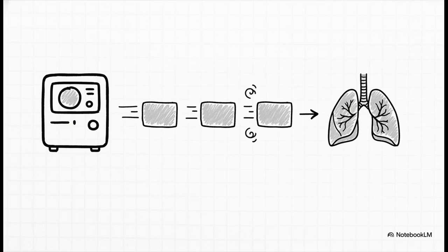And this seems to play out in practice, too. I mean, if you're in a common mode like volume control, you set the tidal volume, and the assumption is that the ventilator delivers that exact same amount of air with every single breath. Seems simple enough, right? Well, this is where things start to get a little more interesting.